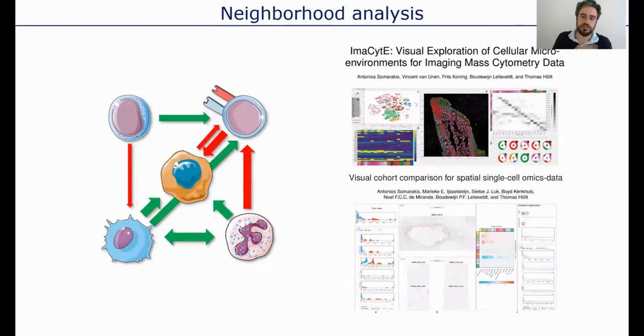Finally, the imaging also allows us to investigate in depth the relation between all subsets that have been identified, and whether differences in the spatial arrangements of cell subsets also play a role in pathogenesis. And this is a glimpse of what we've been doing, in addition to numerous projects that are currently ongoing in combination with the clinics to try to extract information that is valuable in different tumor types, and particularly in the context of checkpoint blockade treatments of cancer patients that are undergoing immunotherapy.